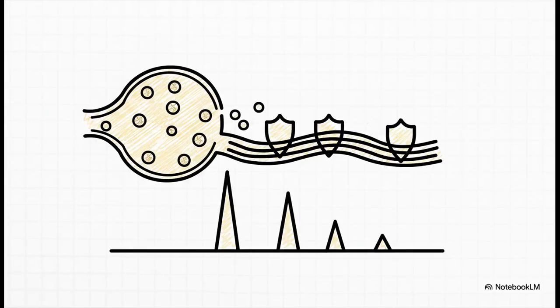Okay, so what's actually happening down at the cellular level when we run a TOF? Let's talk about FADE. Think of the neuromuscular junction like the front lines of a battlefield. Non-depolarizing blockers, like rocuronium, don't just block the postsynaptic receptors on the muscle side, they also block the presynaptic receptors on the nerve side. This effectively traps the nerve, preventing it from rapidly mobilizing fresh acetylcholine vesicles to the front lines. So when you shock that nerve 4 rapid times in 2 seconds, it instantly depletes its immediately available acetylcholine. And because the drug is blocking new acetylcholine from moving up as reinforcements, each of those 4 twitches gets progressively weaker and weaker. That progressive weakening from twitch 1 to twitch 4, that is the FADE.